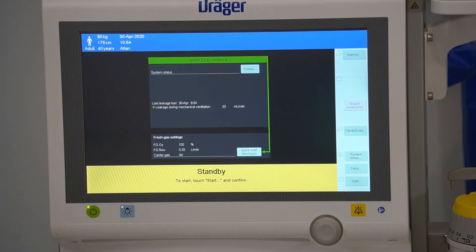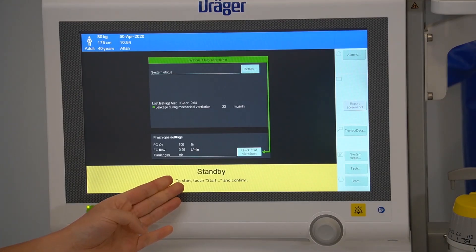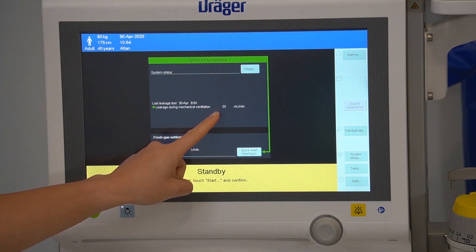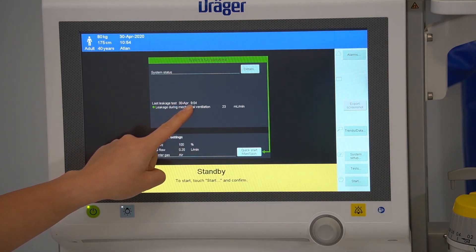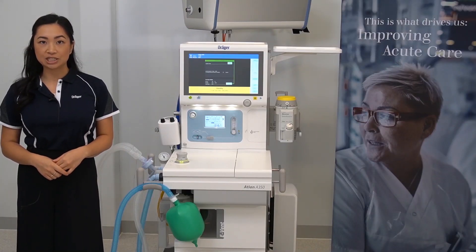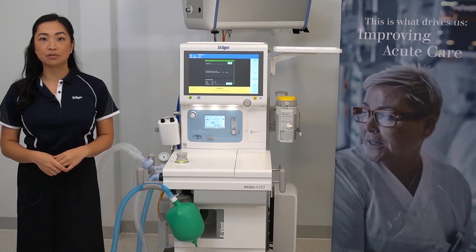On completion of the leakage test, the device will return to the standby screen. Your new leakage value will be displayed here with the relevant date and time stamp. For further information, please refer to the instructions for use or contact your local Drager representative.